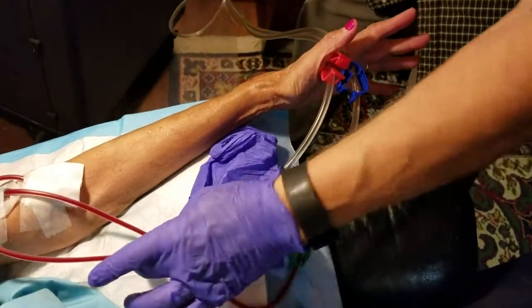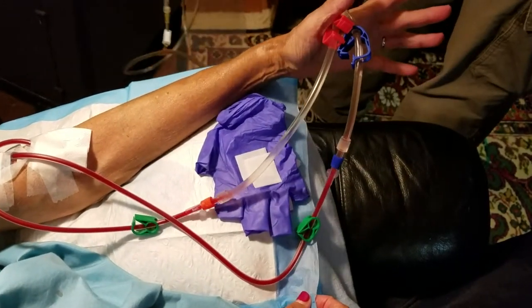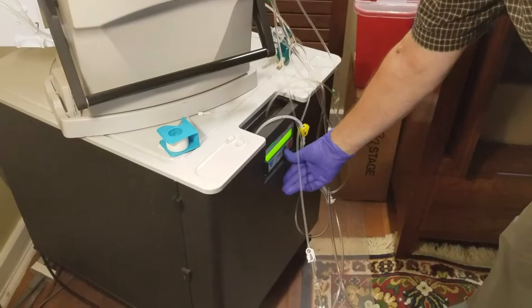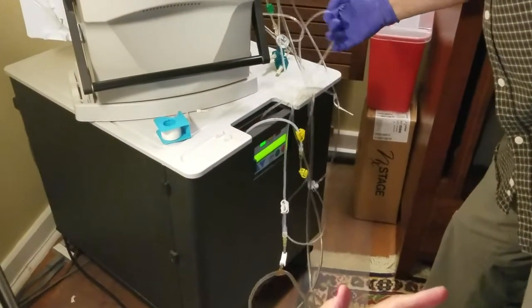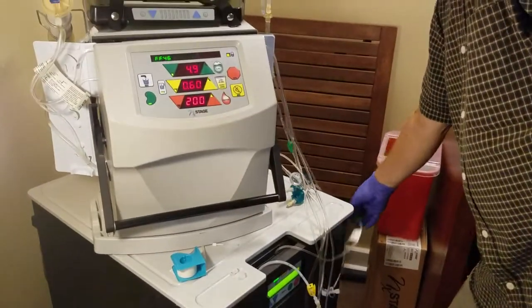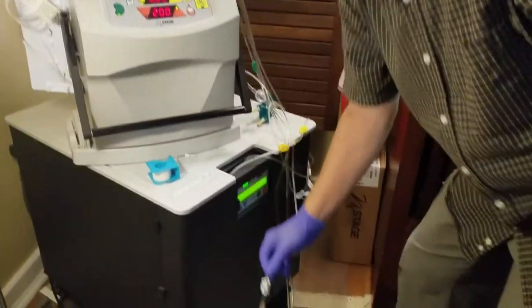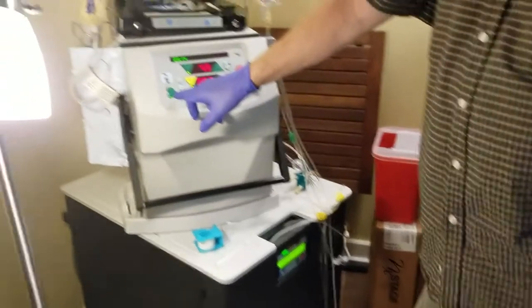So the greens are open. Connections are made. The red and blue are open. I'm gonna turn the cycler on — I always hit it three times. Greens are open there and there. Yellows are connected and open. And the whites — the whites are closed, so that no fluid from here flows back into her. And so now we're gonna hit the kidney button.